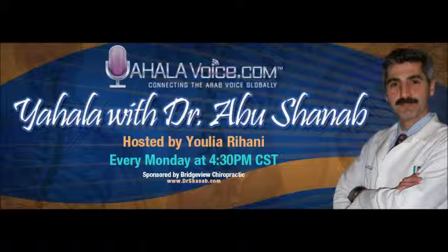And there are several types of MRIs, closed and open, and they come in different strengths. The strength of an MRI machine is measured in Tesla units, and they could be anywhere from 0.3 to 3 Tesla. The most commonly used, most efficient for routine work would be a 1.5 Tesla machine. The higher field strength machines are used mostly for research, for brain functional studies, for abdominal work. And the closed MRI is a long tunnel, usually about 4 to 5 feet in length, and the diameter is anywhere from 37 to 45 cm.